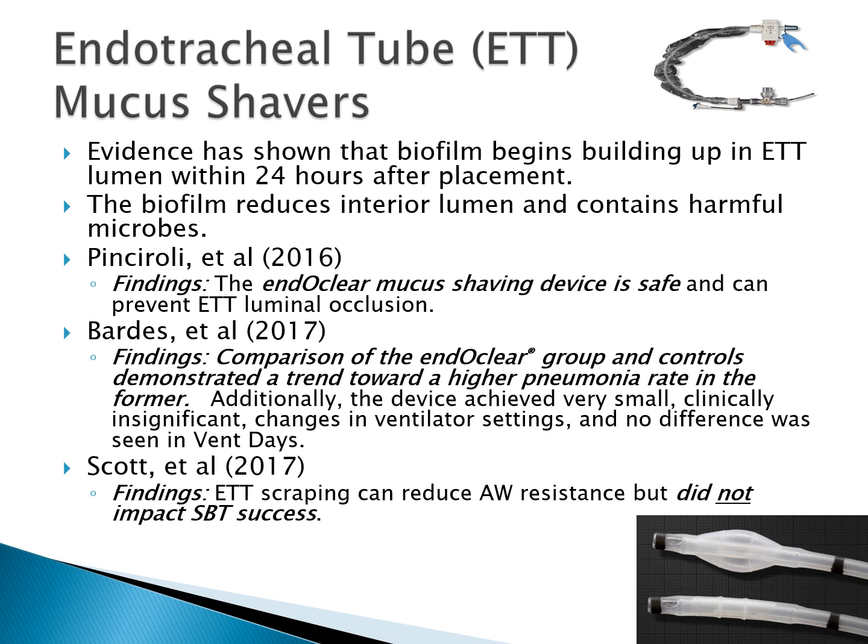You're changing the inner cannula every 8 or 12 hours or whatever. So just imagine if that can build up in a trach tube in half a shift, in 12 hours or half a day, to think about what can build up in the endotracheal tube. So mucus shavers can be helpful in harvesting the biofilm and restoring the inside lumen of the artificial airway to its original diameter or circumference. The other thing it can do, by removing that biofilm, is reduce the chance that some of that biofilm will end up down in the lower airway and cause a pneumonia.